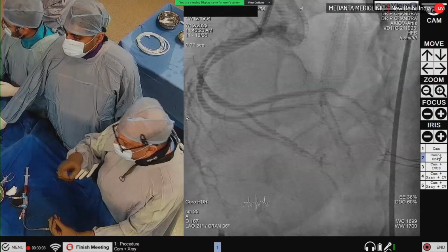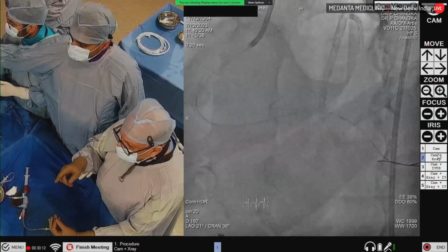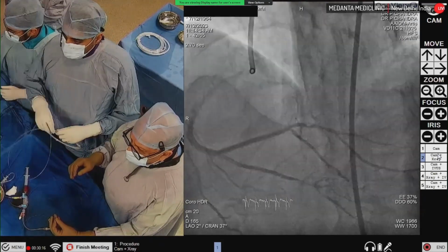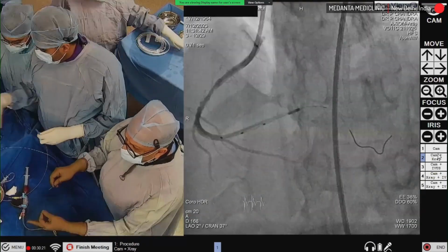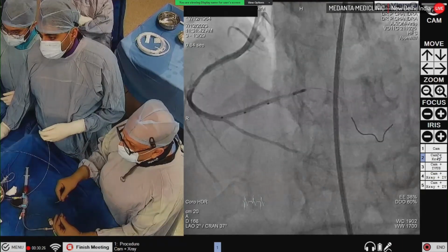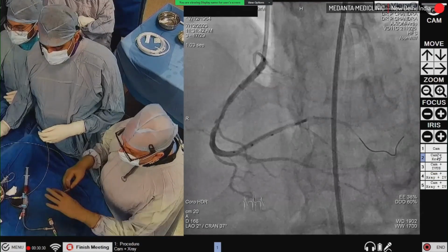Show me the first shot, please. I want to just identify what our landing zone is for this. Okay. Next, please. Next. Yeah. So here it was just after that branch, there was an issue, right? So we'll go right from there.